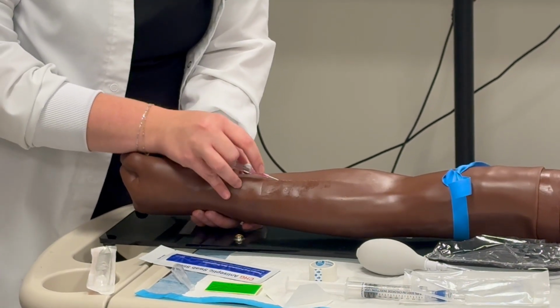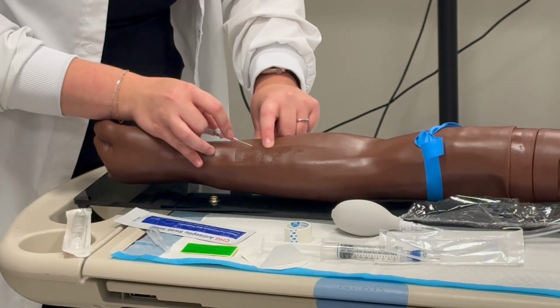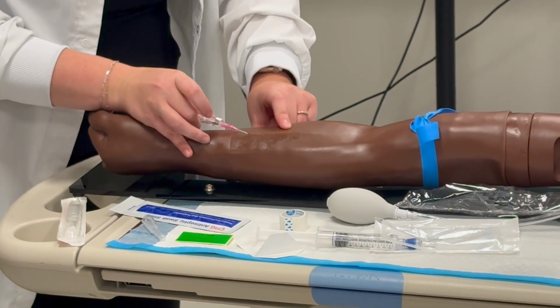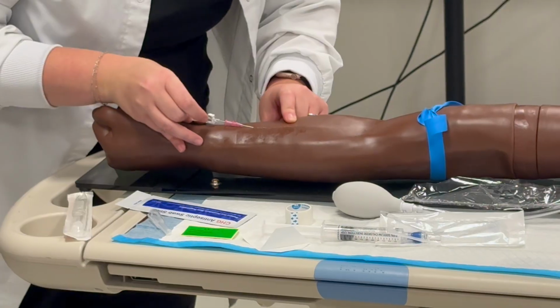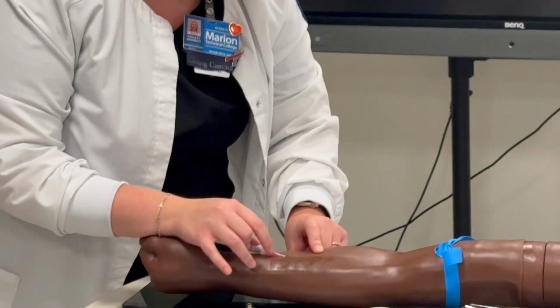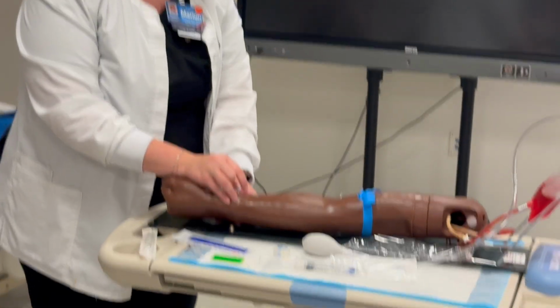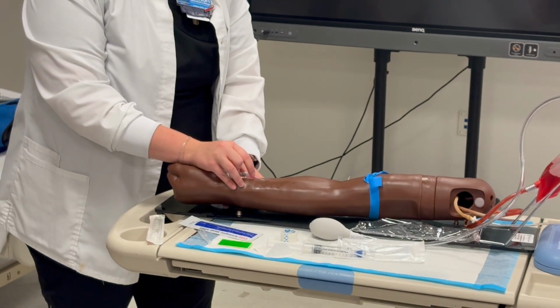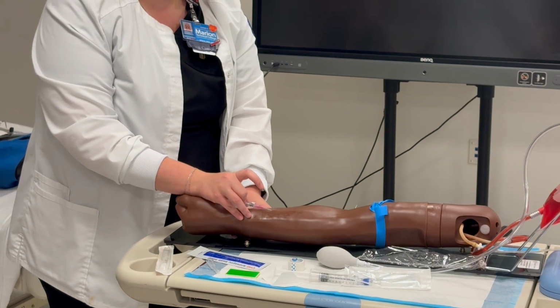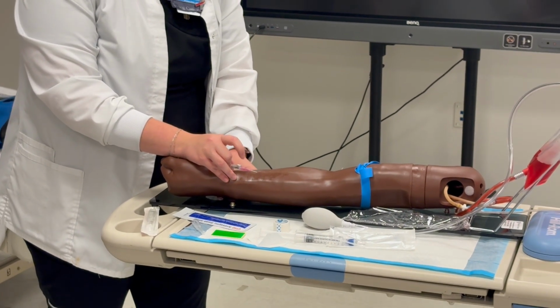Okay. It feels like this is not what you would do. I'm just doing this for the purposes of showing you guys. And we don't care if you actually get the blood return when you are checking off. We care about how's your technique and do you understand the skill. We don't care if you actually successfully do it. It's hard in the moment if I don't get it. I tested all these yesterday. They can be finicky. So I'm going to verbalize.